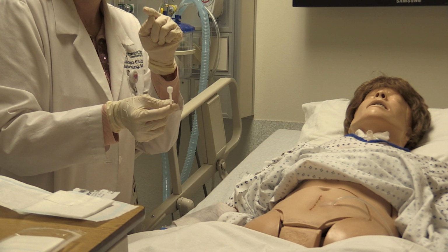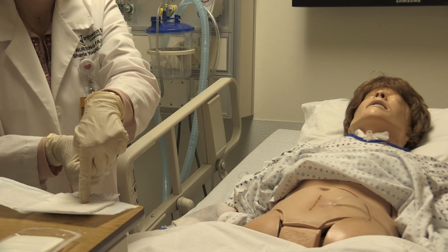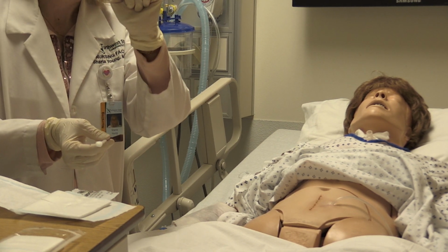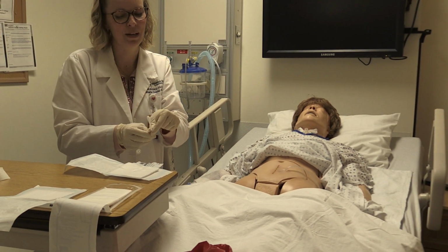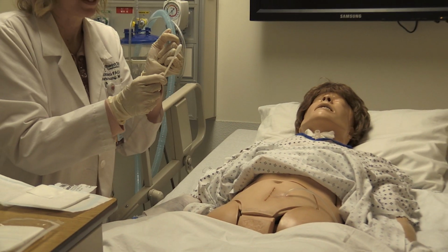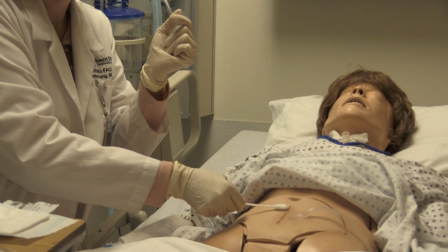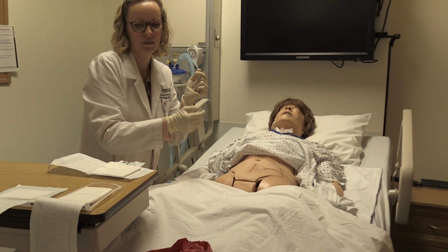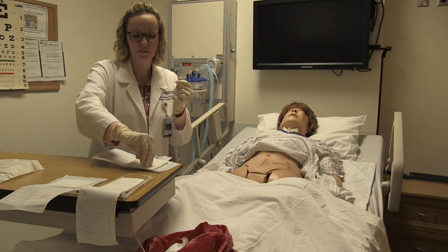Did you all notice what I just did there? Anyone catch it? I went like this, which is a big no-no. So I crossed over or under, so we need to make sure that it's best if you do this and then switch over. So, see, we all make mistakes. All right, then we're gonna go to the proximal side, and again, just scroll down like that. Throw that away. Now I'm going to apply my drain sponges.